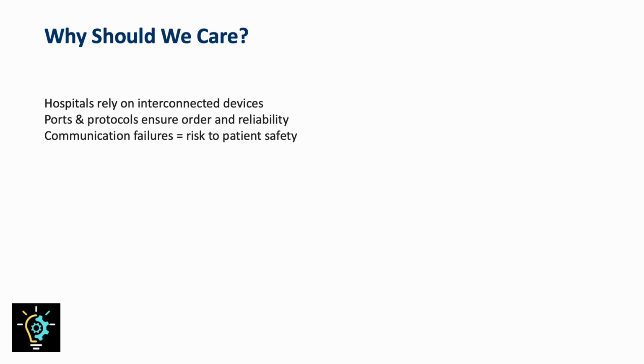They ensure that information flows correctly from one point to another. For example, a heart monitor sending ECG data to a central station relies on TCP/IP to deliver information safely. The reliability and security of these protocols directly impact patient safety.